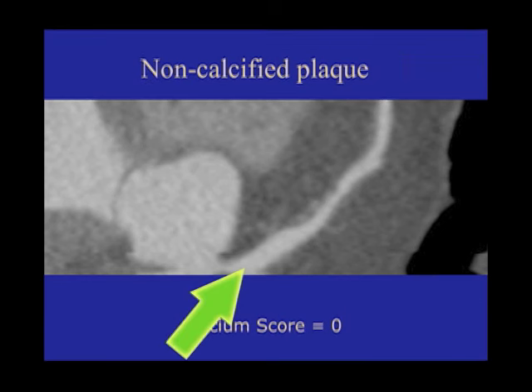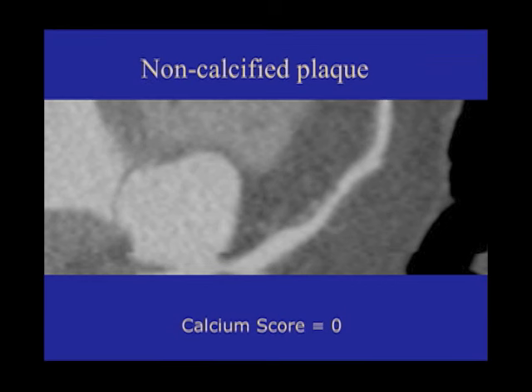The thing you have to be careful about is with coronary calcium — if you're just looking for calcium, not all atherosclerosis is calcified. This is a coronary artery; this is the beginning, and as it comes out it should slowly taper and get smaller. What you're looking for is an abrupt tapering where it gets narrower very quickly. This here is actually some atherosclerosis which is not calcified.